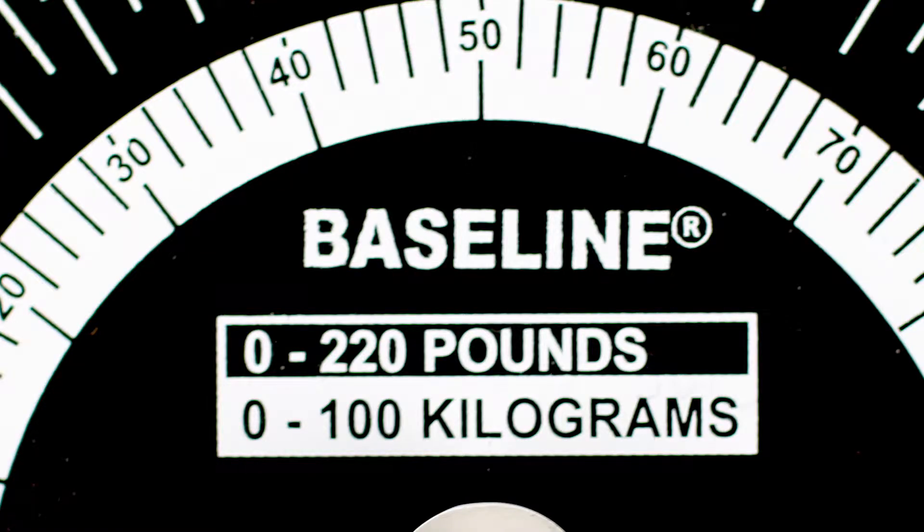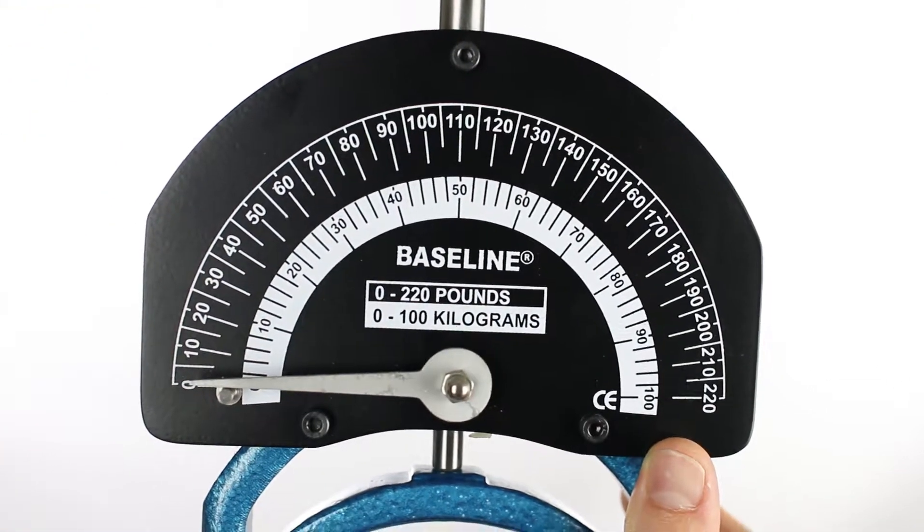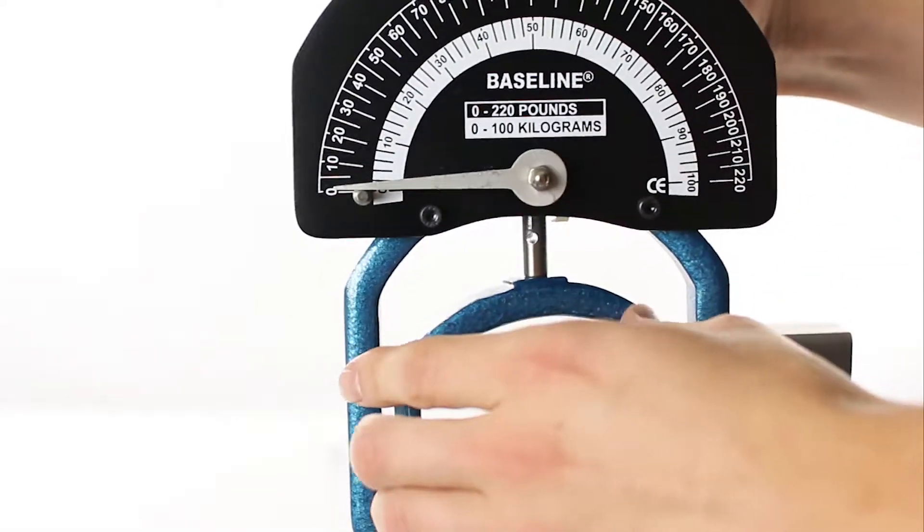The baseline Smedley dynamometer measures both pounds and kilograms at a maximum capacity of 220 pounds. The indicator will retain the maximum reading until reset. The adjustable handles comfortably accommodate any hand size.